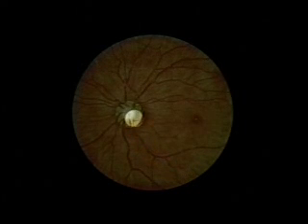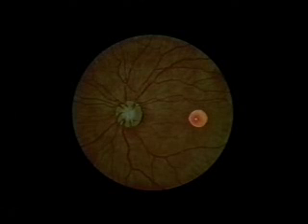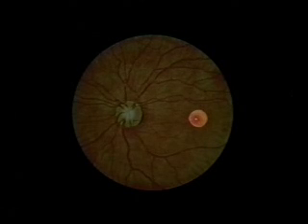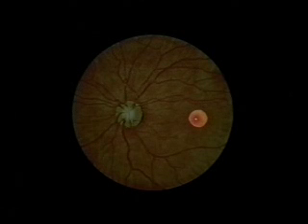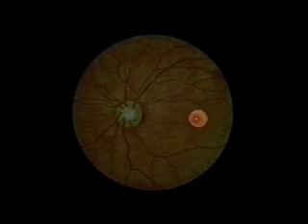Finally, examine the fovea and surrounding macula by directing your light beam laterally or asking the patient to look directly into the light. The tiny bright reflection at the center of the fovea may help orient you.